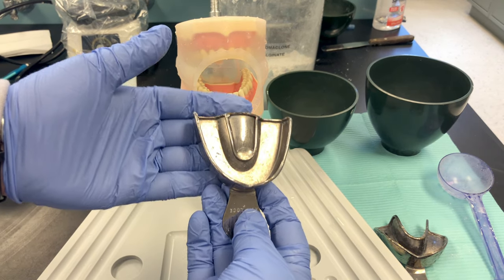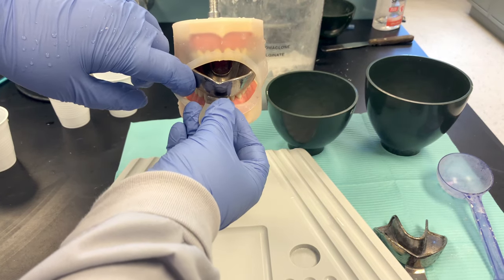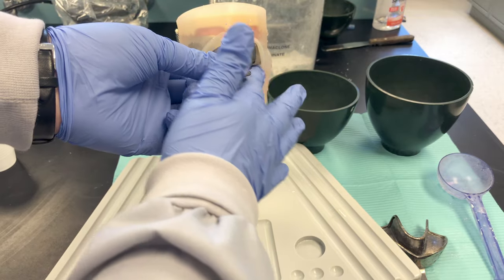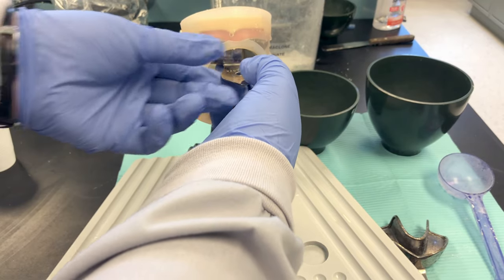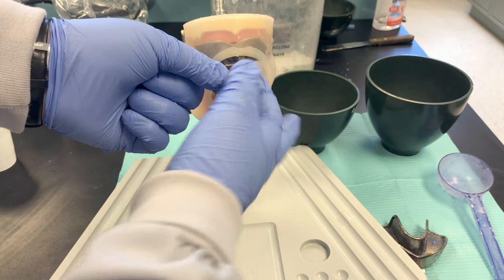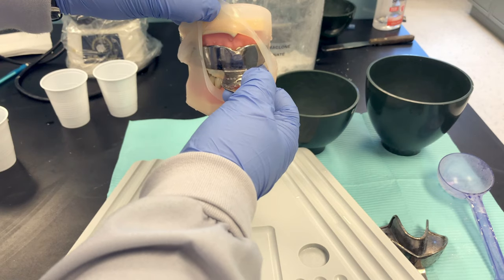Try in your maxillary tray the same way — retract one side, insert at an angle to stretch out the opposite cheek. Seat the posterior first, then swing the anterior into position. Make sure their lips are outside the tray. When seating a good maxillary tray, make sure it extends past the tuberosity area and covers all the teeth.